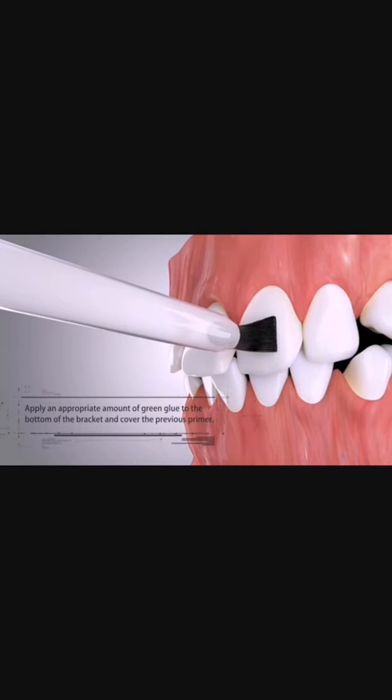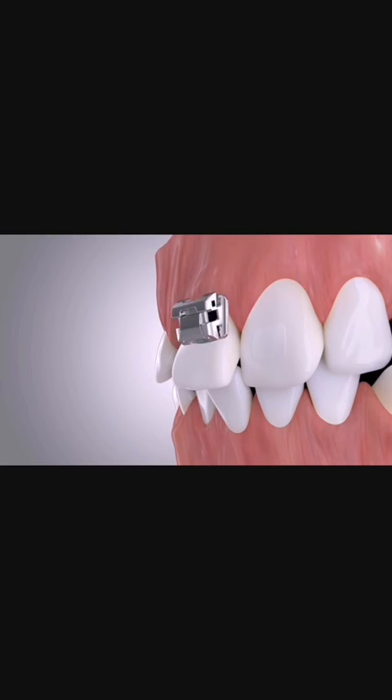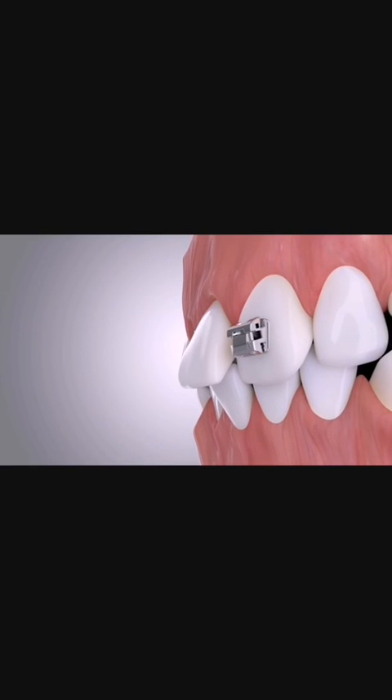Apply an appropriate amount of primer to the etched teeth and the bottom of the corresponding brackets. Apply an appropriate amount of adhesive to the bottom of the bracket, covering the previous primer. Position the bracket at the corresponding dental position and slightly pressurize it. Timely remove the residual adhesive spilled around the bracket to keep the teeth around the bracket clean.